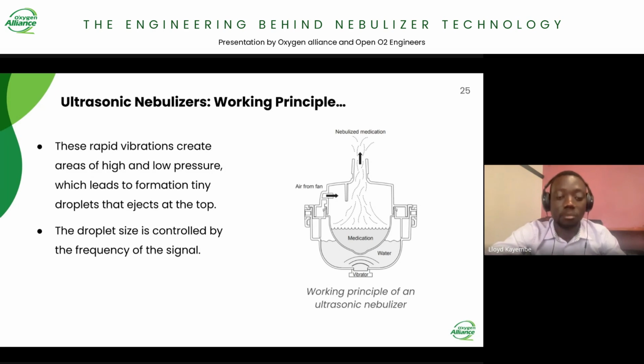hence creating the mist itself. The frequency that is being applied to the piezoelectric crystal is crucial because it determines the size of the aerosol droplets or the size of particles that are being produced in the mist. The higher the frequency, the smaller the droplets. So that's basically how the ultrasonic nebulizer works.